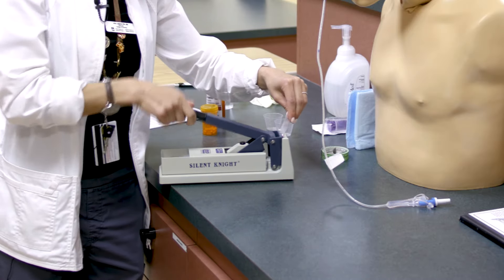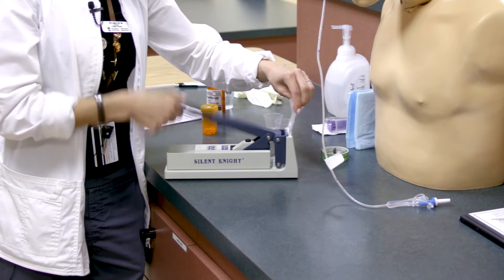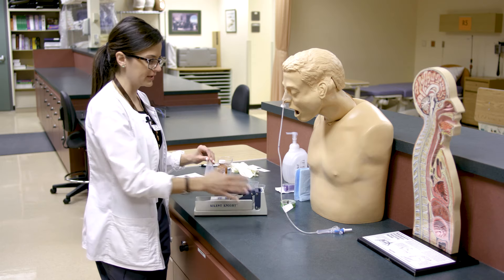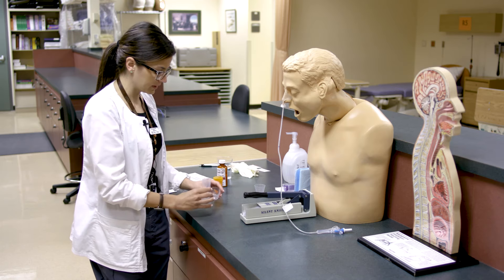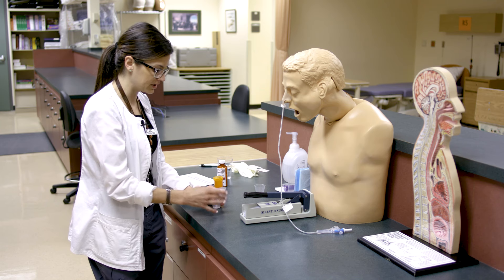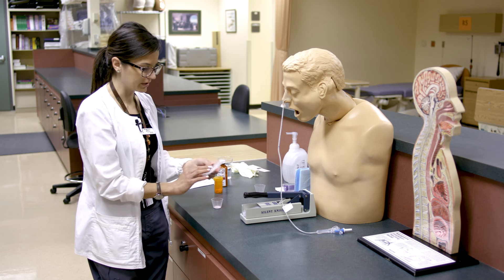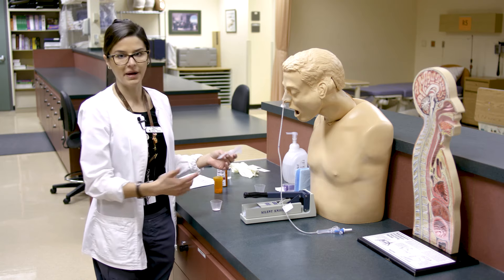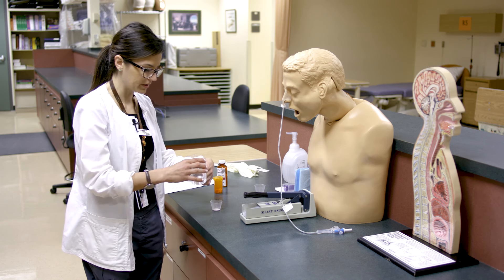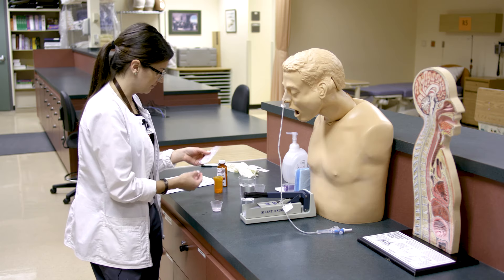Small blows are more beneficial than hammering it hard a couple of times. You really want it to be a fine powder so it doesn't clog your tube. Then transfer it from the bag into a med cup — give it a little flick to get as much medication out as possible. You don't want to lose medication since the patient won't get the full dose, though inevitably you'll lose a little powder. Another option is to put water in the bag to rinse it out and dump it into the cup as well.